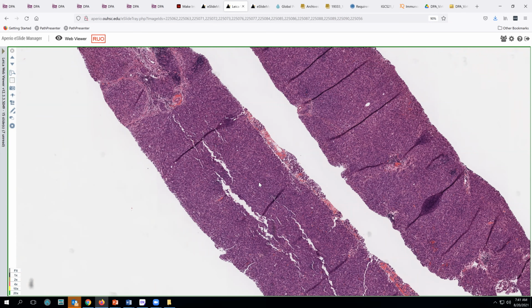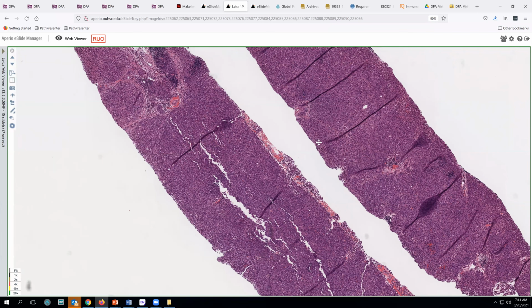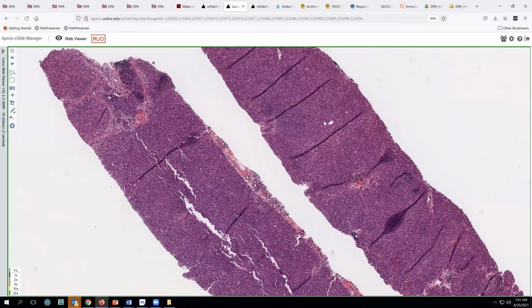Now, if at the same time the radiographer had biopsied the breast sample, then of course we would use the Nottingham grade, and we wouldn't need to grade the axillary node. We would just say metastatic carcinoma consistent with breast origin in that circumstance. Okay, well, let's move on.